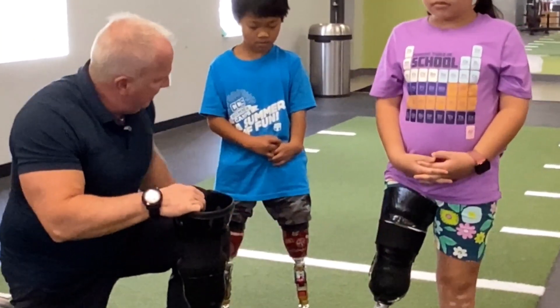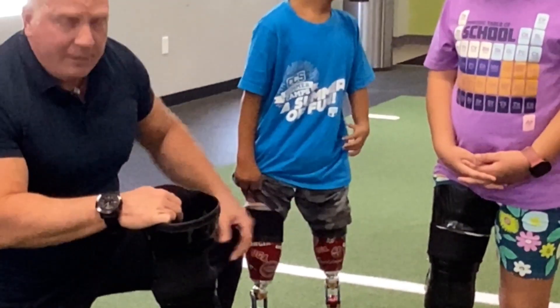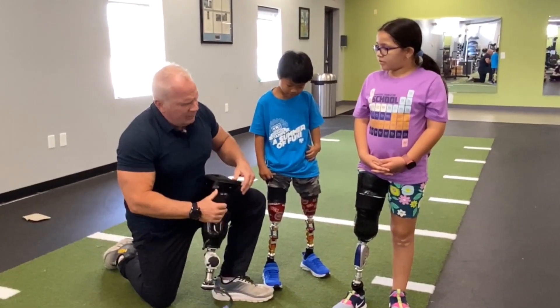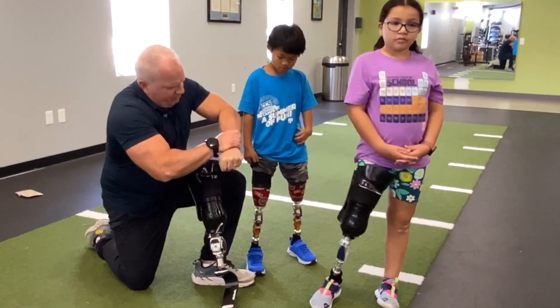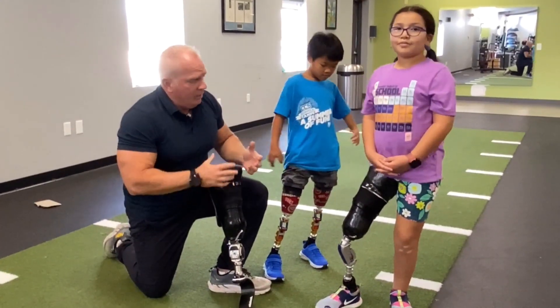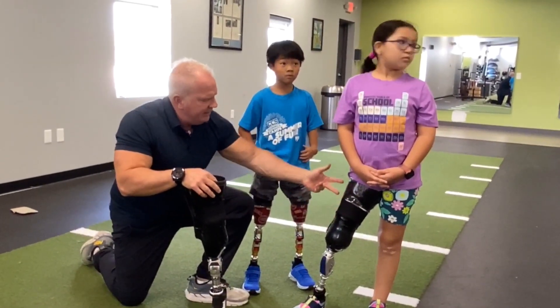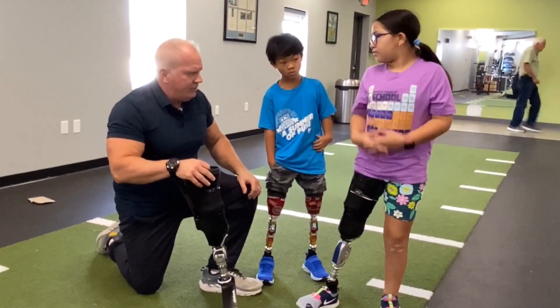We've been able to see a tremendous amount of growth in this system as far as the muscles being able to fire. We can actually take advantage of the loading forces the person can take on the bottom. Prior to this, with the knee disarticulation, we would have to make a socket where all the skin tension would go in and pull the tissue, and as a child grows they wouldn't fit in the leg anymore. Now we're able to allow these sockets to grow with the child — we can increase the length of them. The only thing we see is if the muscles get too big, then we have to change that out, but everything else is pretty good.